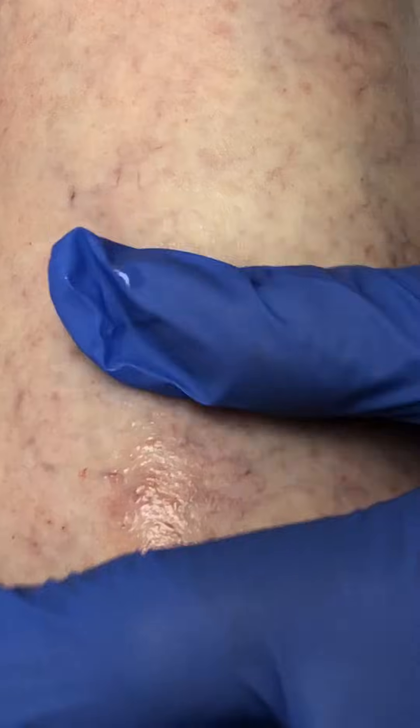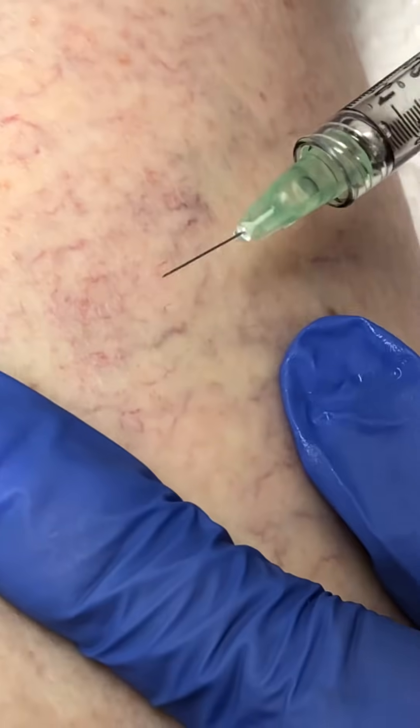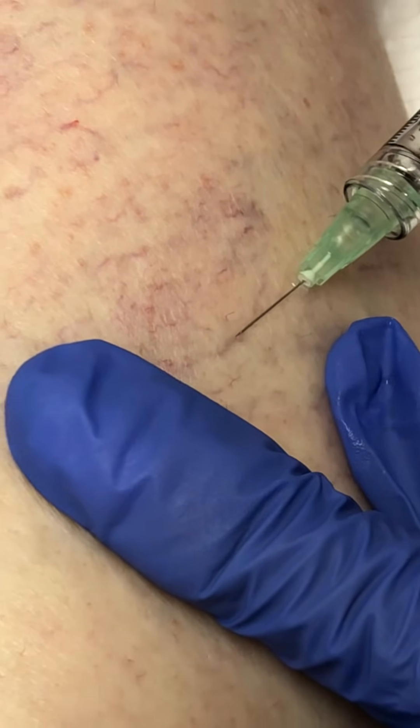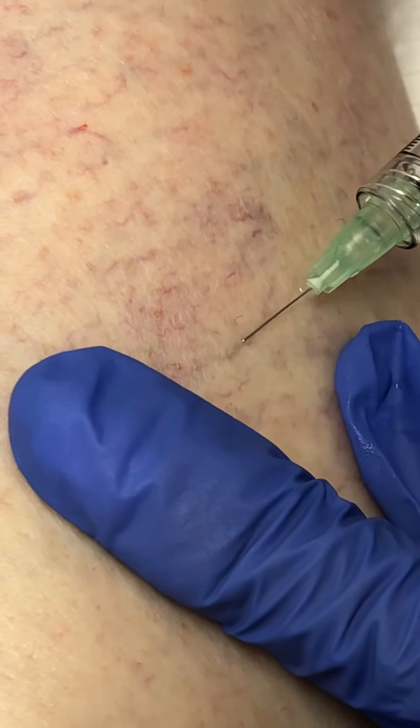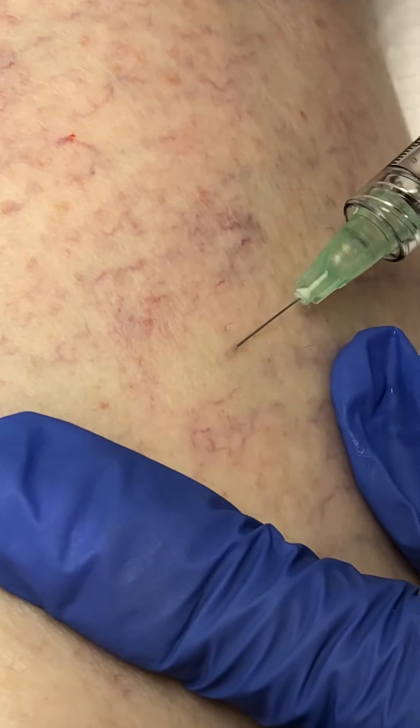It looks simple, and as we know in life, things that look simple are not quite so simple. So we want to avoid extravasation into the dermis. That's why I bend my needle up a little bit. I inject very superficially, get right into the vein. Sometimes you can feel a little pop. But there we go — we got it.